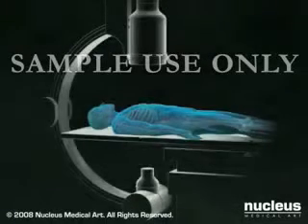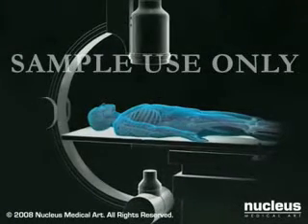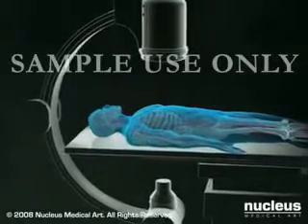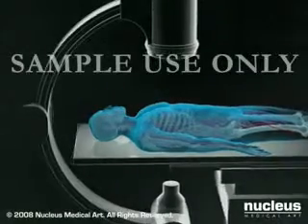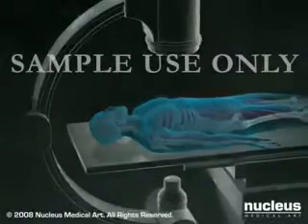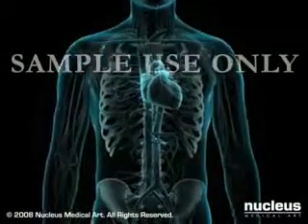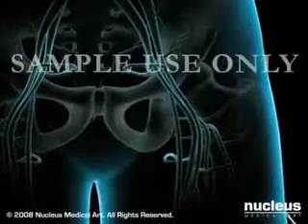Before the procedure, you will be placed on a table equipped with a fluoroscope, an X-ray imaging device. During the procedure, the fluoroscope will move around your chest in all directions to record pictures of your heart and coronary arteries from multiple angles. Most cardiac catheterizations take place through the femoral artery in the groin, but can also be done through an artery in the arm.